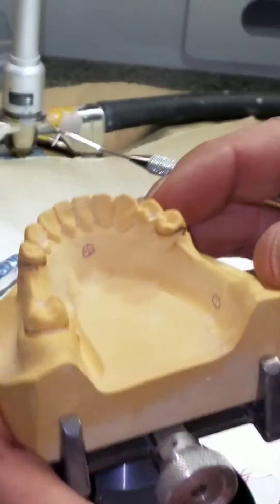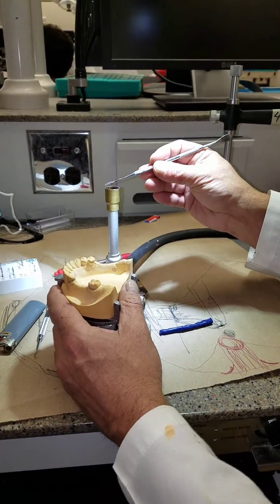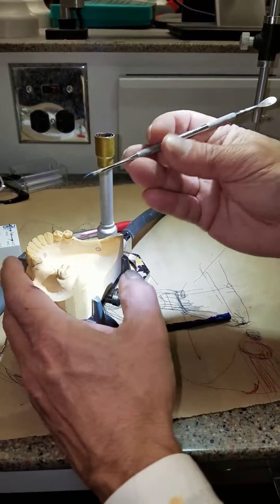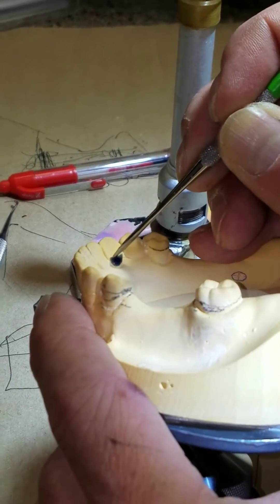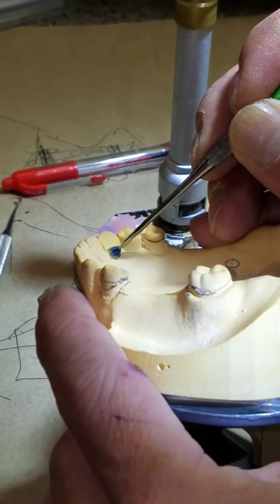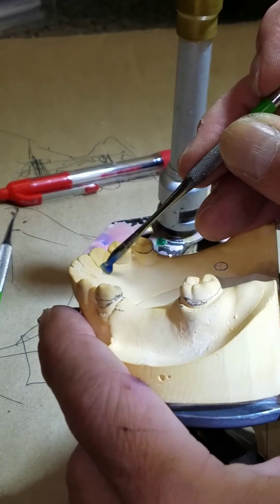So that's a subtractive — let's do an additive real quick. All additives are added as chevrons. If you want to try chevrons on a subtractive-type rest, that's perfectly fine. These rests are always down here in the cervical third — that's where your enamel is the thickest and it's out of the way. Additives are used when you don't have enough enamel thickness to do a subtractive. The blue here is representing composite.